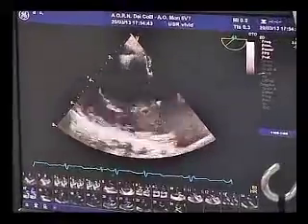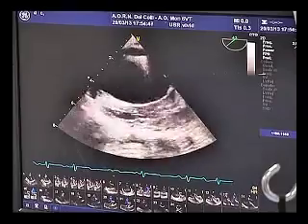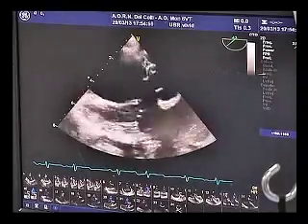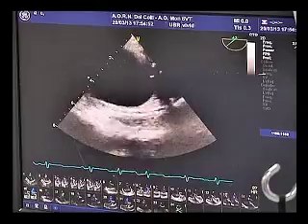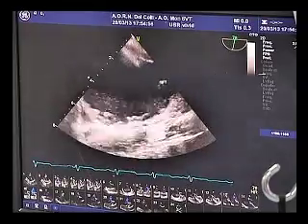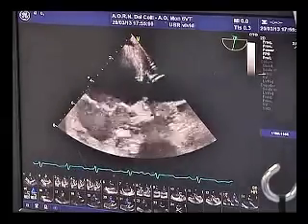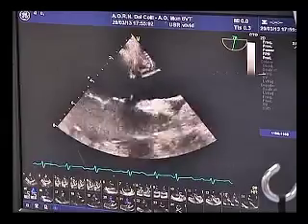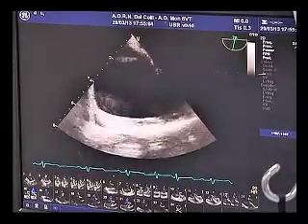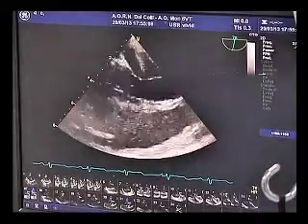Yes, but the second one collapsed, it didn't stay in position. So probably for the second one we need to put a bigger device inside. It may be. Now we have to try again to probe the first one, I think.